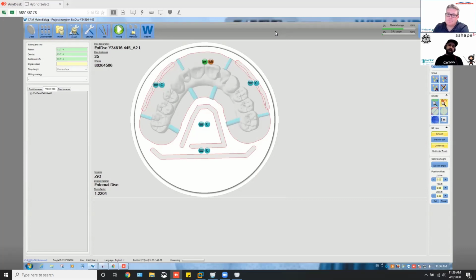So what I did was I extended the climb time up to the high temp of 1515. I extended it from 10 hours to 14 hours, so it was 16 hours start to finish. I put it in a round tray. I put the standing one on one side, and I took the other arch and laid it down, and I put more beads in there than I normally would for crown and bridge, just so that it acts as a cushion. And I set it in, and I just prayed to the zirconia sintering gods.